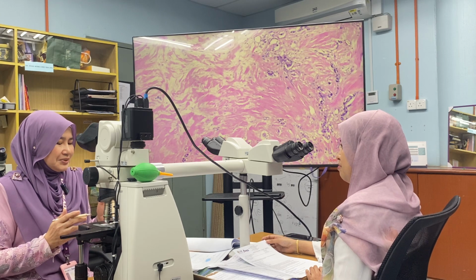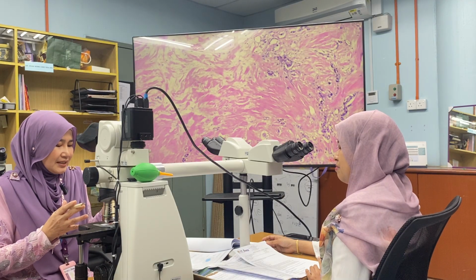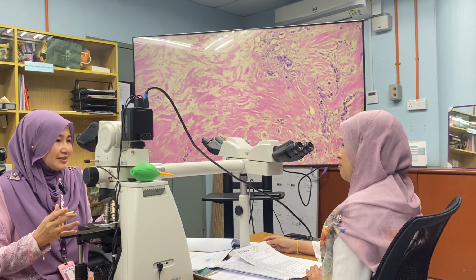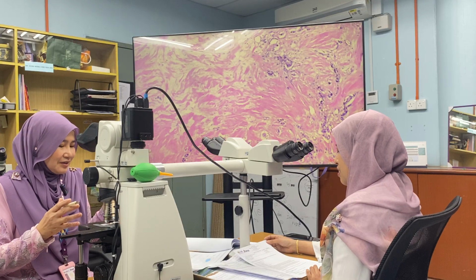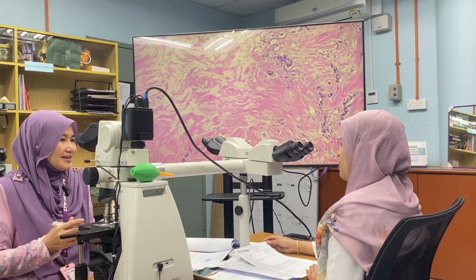But what we need to do is to assess the cellular changes, the cells within the DCIS. Maybe now, just like in the main tumor, they will be replaced by the histiocytic reaction within the DCIS ductal component. Can you please tell what the changes of the cell post chemo are?